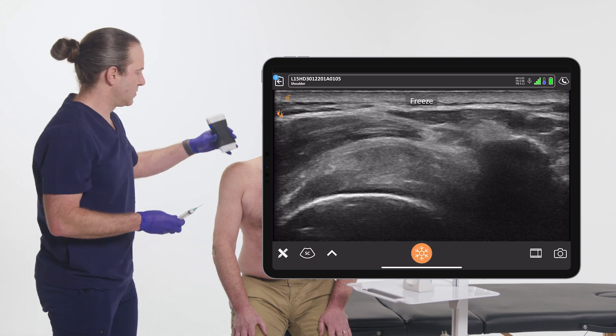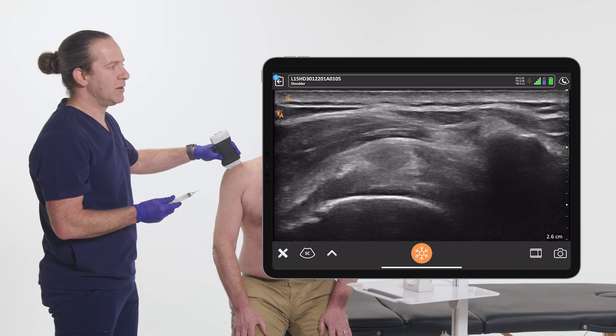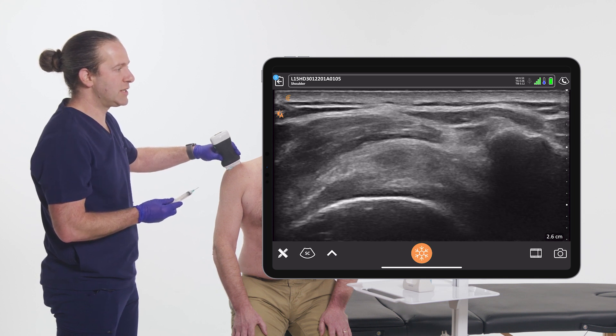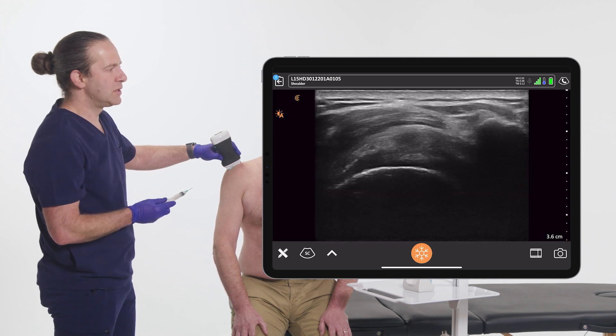Freeze. With the scanner in place and getting ready for the procedure, I can say increase gain, decrease gain, increase depth.